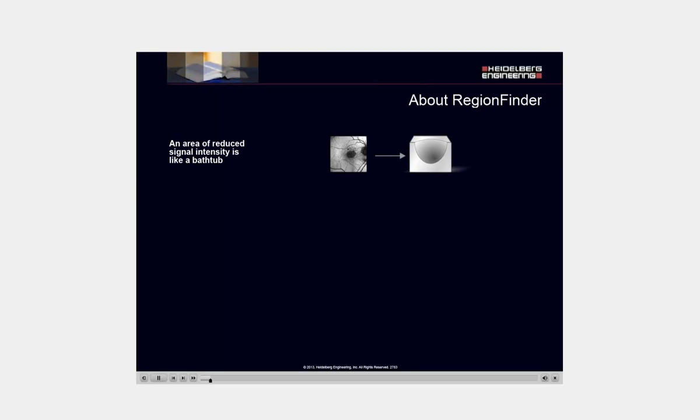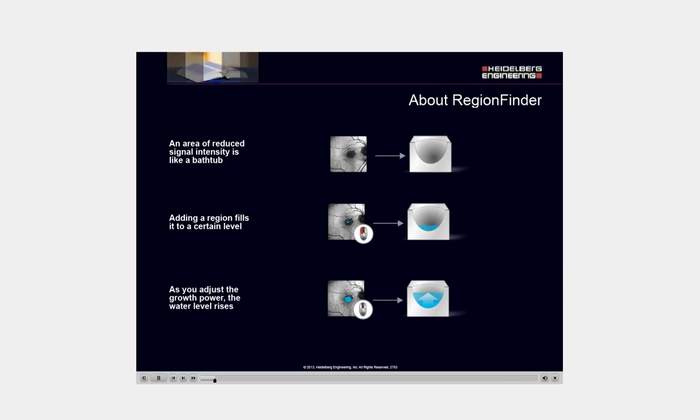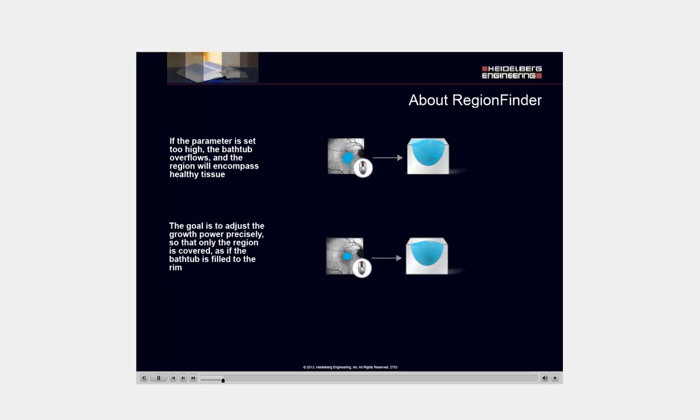An area of reduced signal intensity is like a bathtub. Adding a region is like filling it to a certain level. As you adjust the growth power, the water level in the tub rises. If the parameter is set too high, the bathtub overflows and the region begins to encompass healthy tissue. The goal is to adjust the growth power precisely so that only the region is covered, as if the bathtub is filled to the rim.